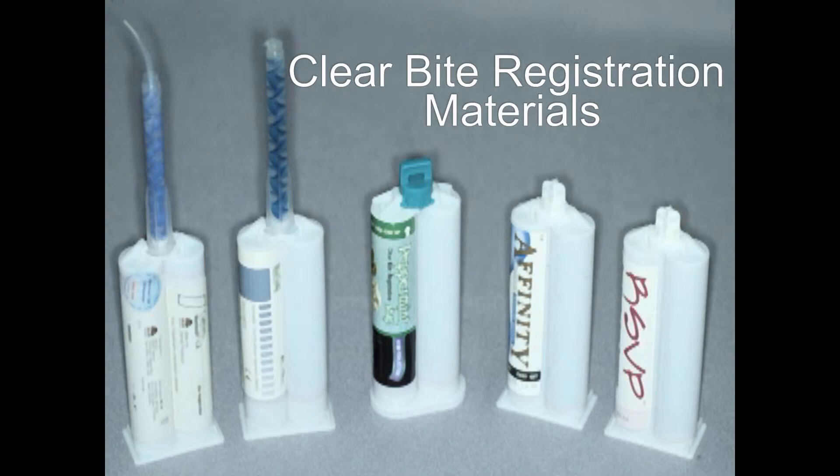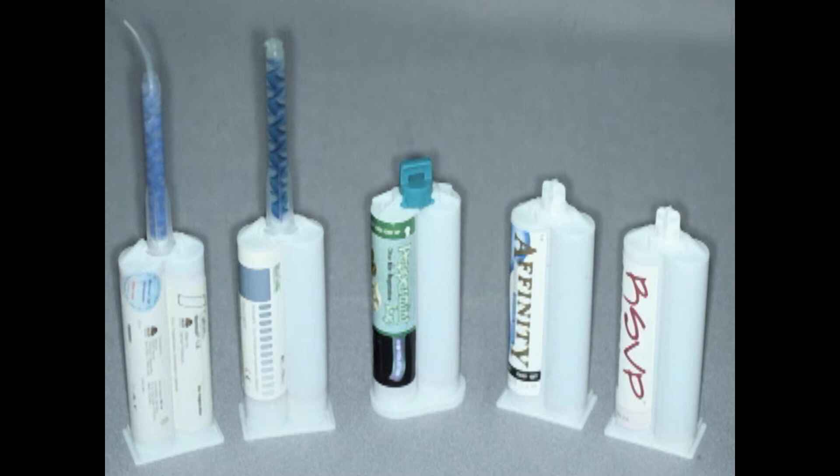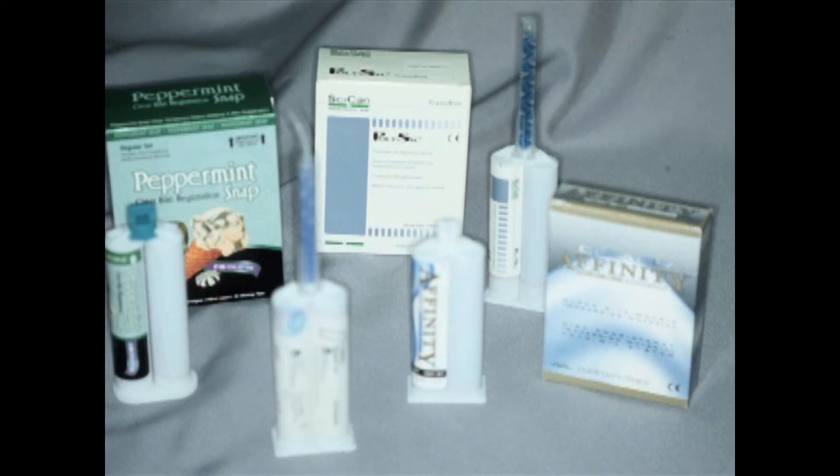Here are some of the materials — I've used every one of these. Every material is a polyvinyl siloxane bite registration material. It's not made for this technique; it's made for making bite registrations. So they can't charge any more for this than for any other bite registration material. I'm using a milliliter or two of this material to make what is called a custom matrix, and I use that custom matrix to reform my composite. These are in your handout. I don't push any one particular material — they all work. I would pick one with a short working time because you don't need a long working time to take this type of impression.